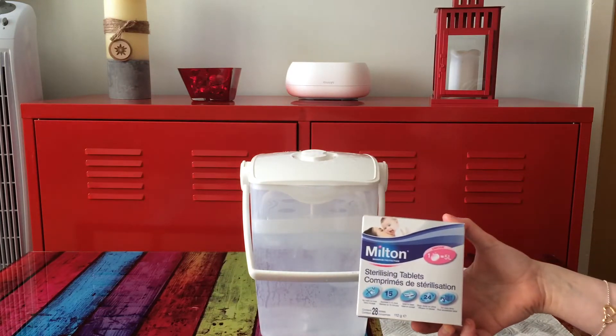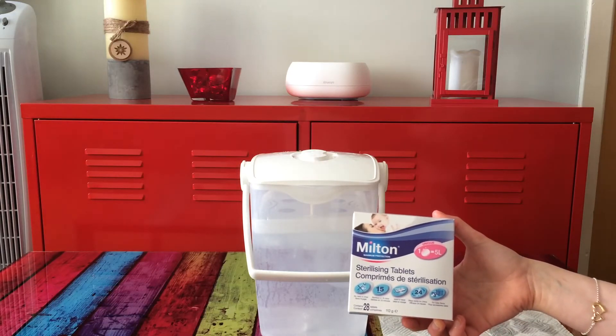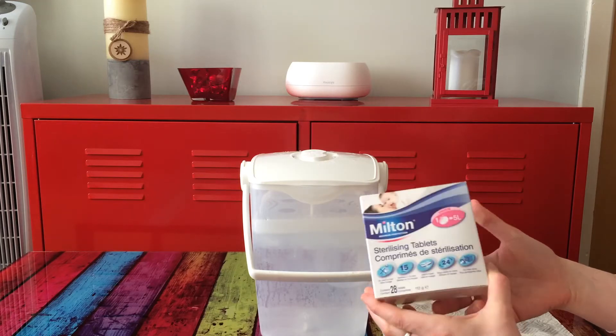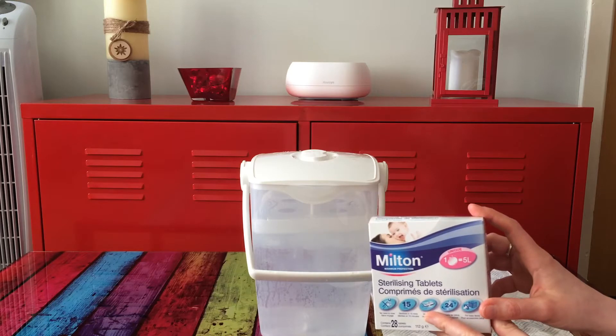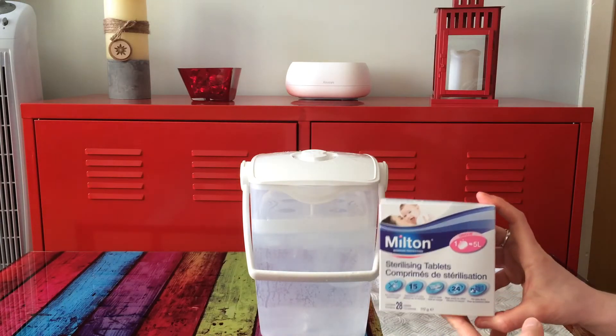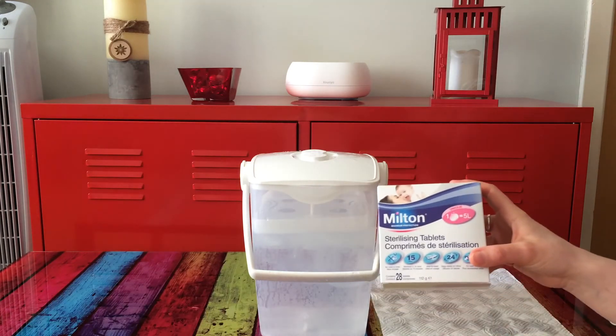The Milton sterilizer tablets you can purchase from Boots, any chemist, or bigger supermarkets. They're pretty cheap as well. I would buy the Milton ones and not any cheap brands, because sometimes there might not be the same quality and I trust Milton, so I'm going with these.